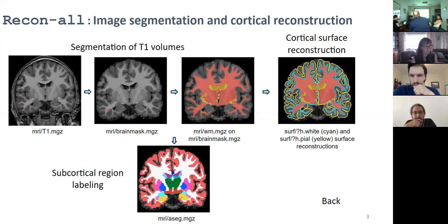It may be that it would be easy enough to identify the lesion, and then if you could do that, where there's a lesion, just bring in some sort of template to help with the registration, or just say ignore this information, only use what's left to match it to a template, and then reconstruction.